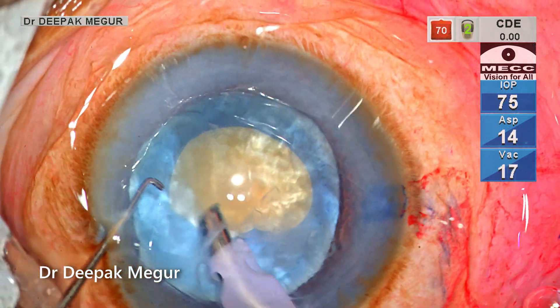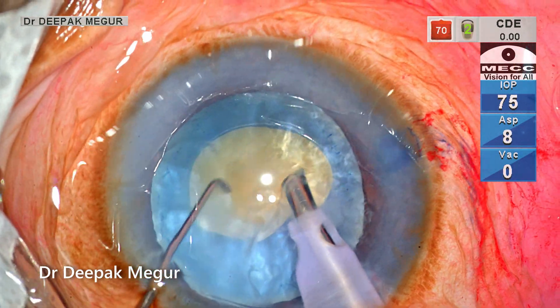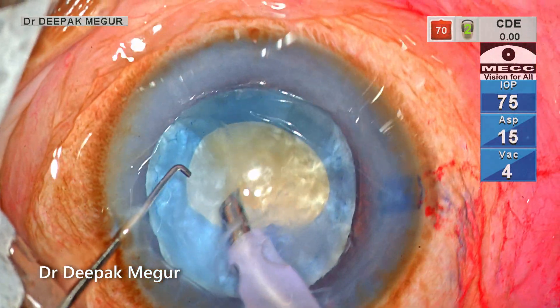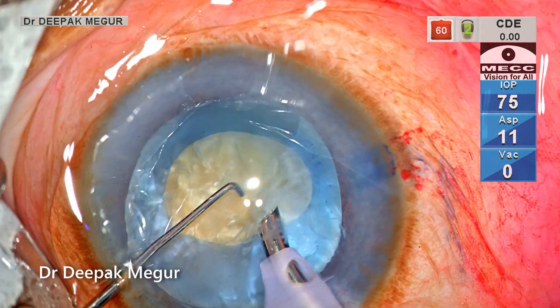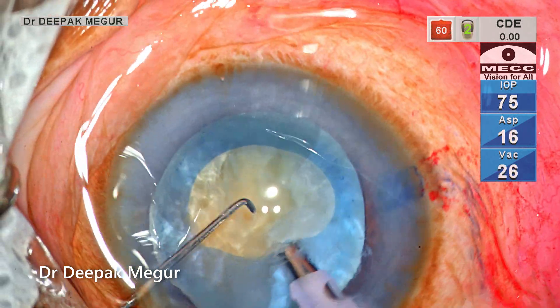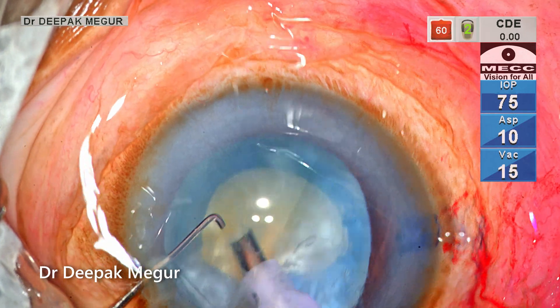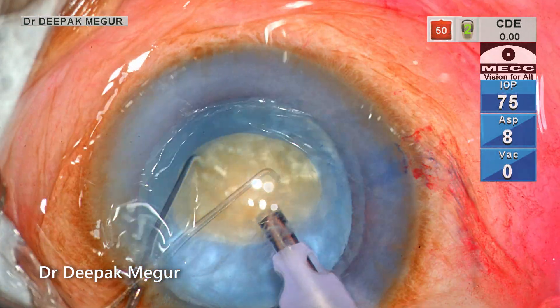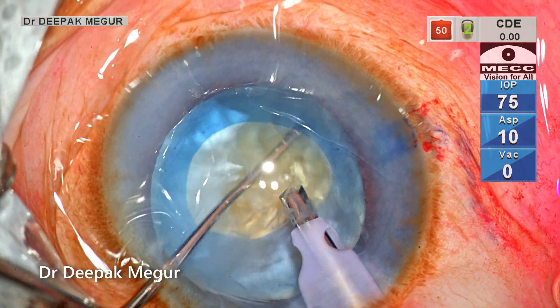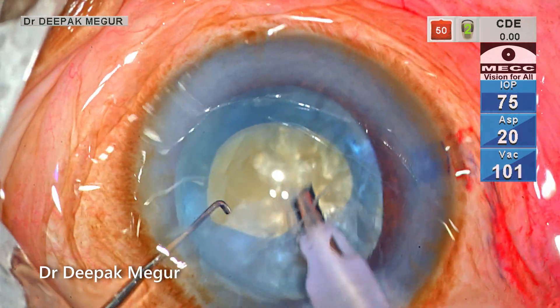The second instrument I'm using is a Sinskey hook, used to tap the nucleus and rotate it slightly so the underlying epinucleus and cortex is loosened and comes out. It's important to decompress from the posterior aspect of the nucleus as well. By tapping and tilting the nucleus with the second instrument, the loose epinucleus and cortex behind the nucleus can be released and aspirated out through the phaco probe.